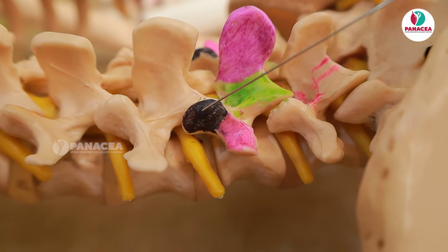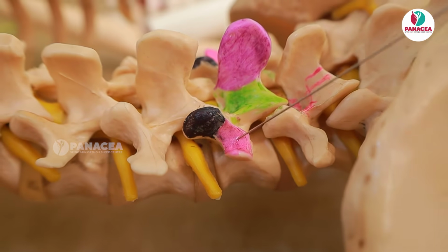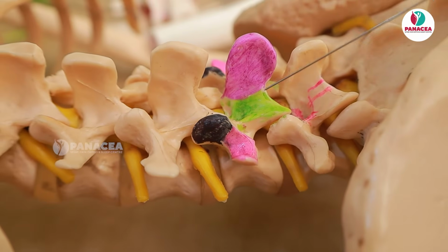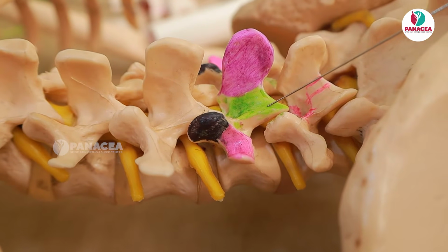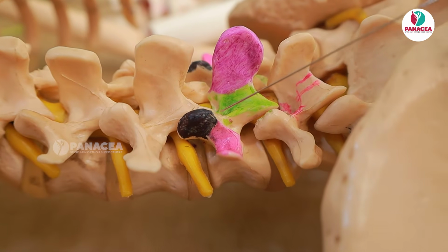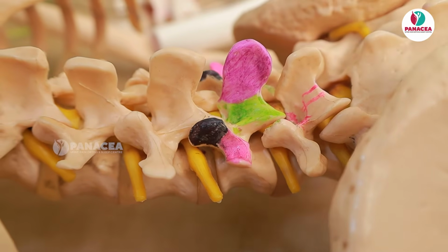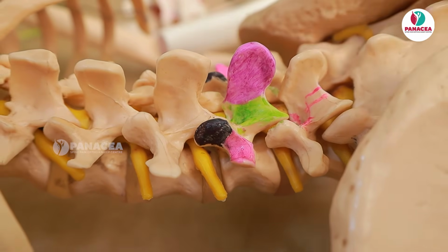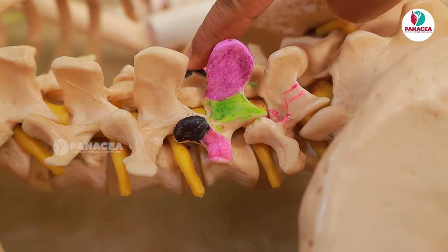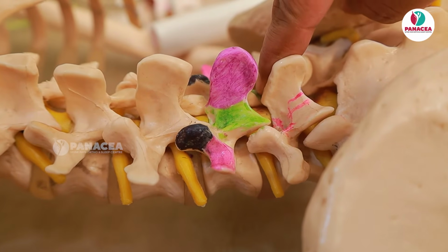In the Scottish dog, the nose is formed by the transverse process, the ear is formed by the SAP, the forelegs are formed by the IAP, and the uncolored area is nothing but the pedicle. The spinous process is almost pushed to the opposite side. The tail is formed by the opposite side SAP, and the hind legs are formed by the opposite side IAP.